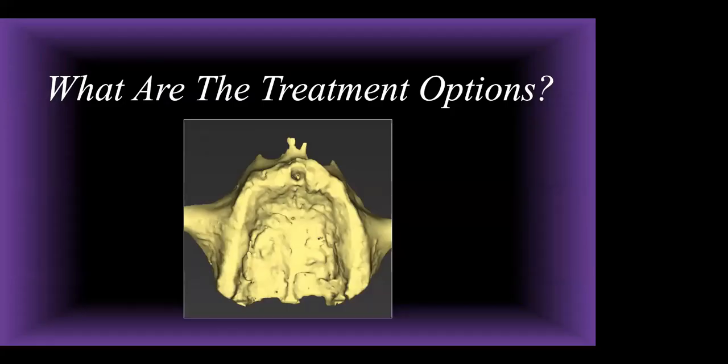So if we look at this edentulous arch, as I explained last session, you always want to give every patient all of the treatment options.